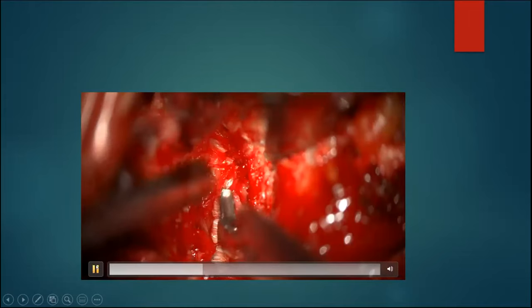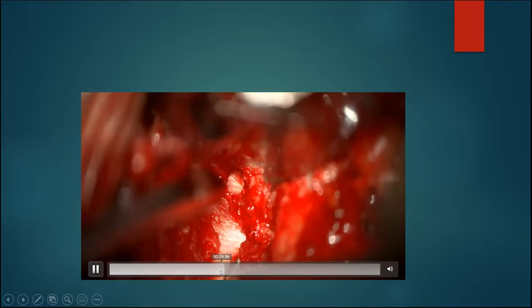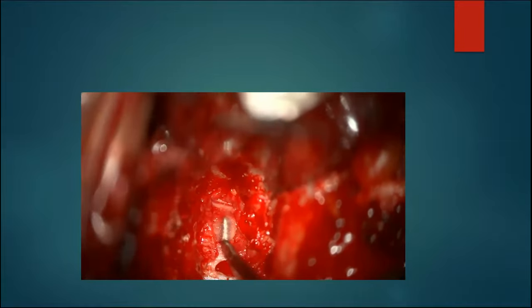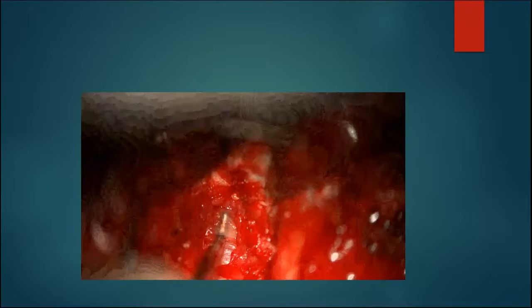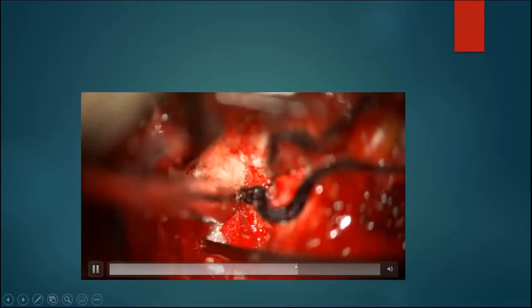Number one, when you're doing an anterior discectomy and you're trying to do the decompression, you will often encounter bleeding, because the moment you decompress, sometimes in the extradural tissue, you will get bleeding. And I'll show you exactly how you deal with that. I don't think I've ever used bipolar diathermy here to stop this extradural bleeding. And when you get bleeding as you decompress, and of course, if you decompress adequately, the bleeding is a good sign. It's a sign you've done good decompression. All you need to do is put a tail cotton, keep your sucker on it, and continue the operation.